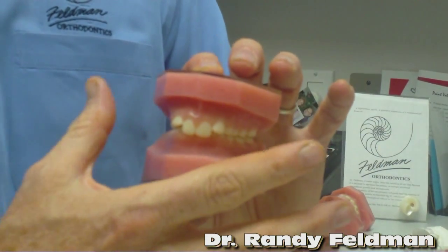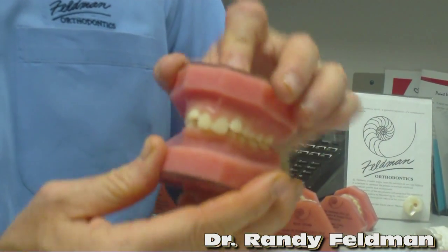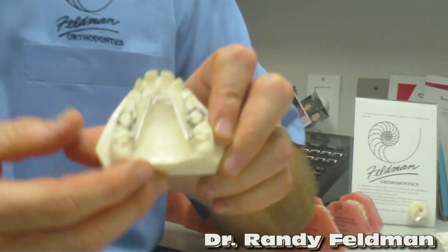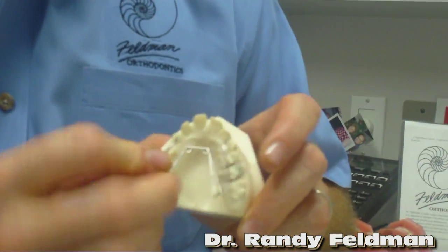The goal is to expand the upper jaw and to open the lower jaw. So this is the before. What we then do is expand the upper jaw — we use a little device that looks like this. It's called a quad helix.